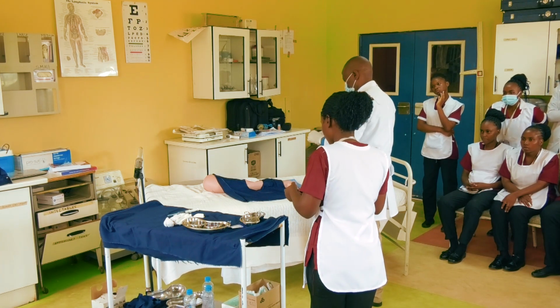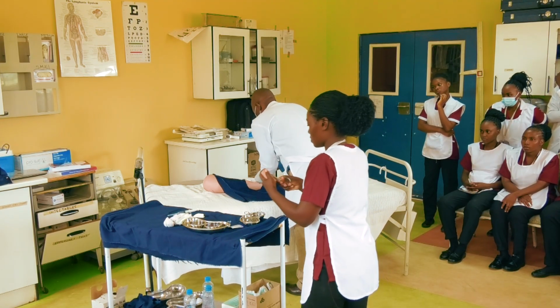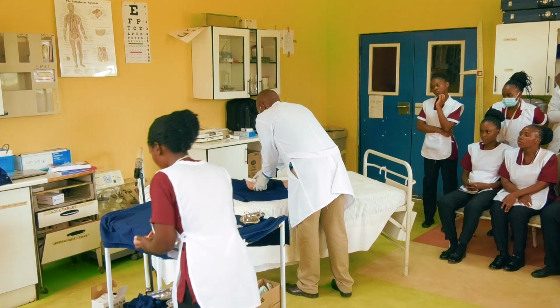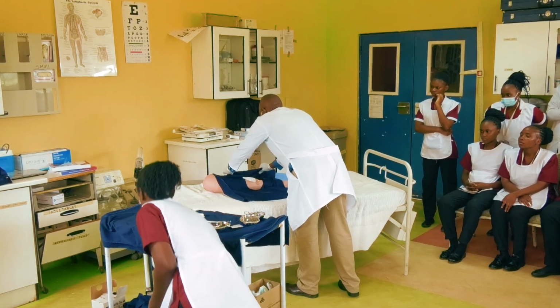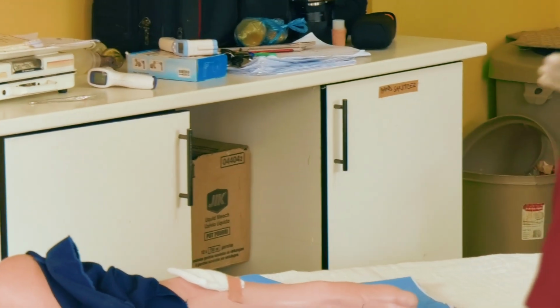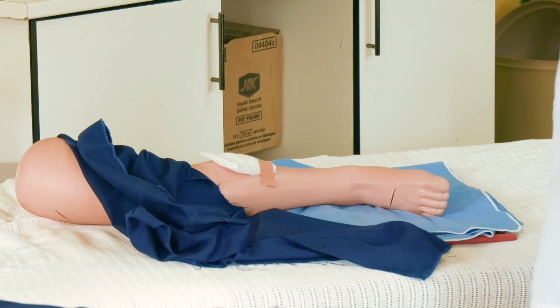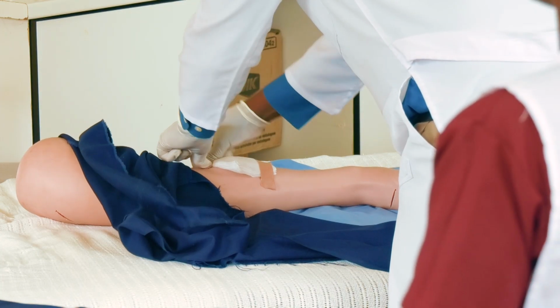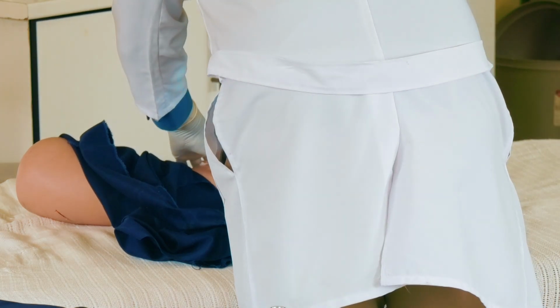Another one. It wasn't short. But anyway, let's do this. So once this is holding, you can remove your dressing, the drape. Oh, she's even doing something short. Okay, so once this is holding, we are good to go. The wound is covered. Just ensure that you strap it well.